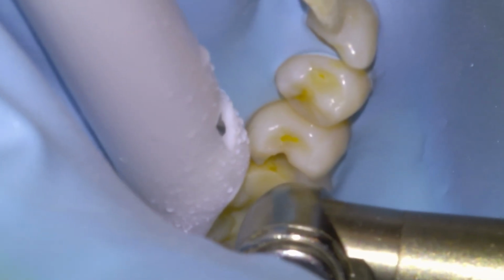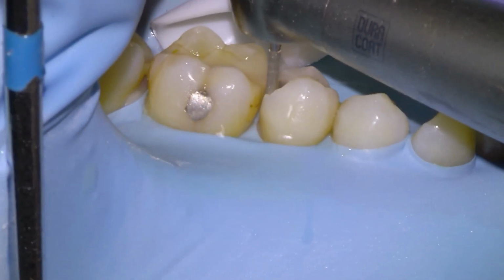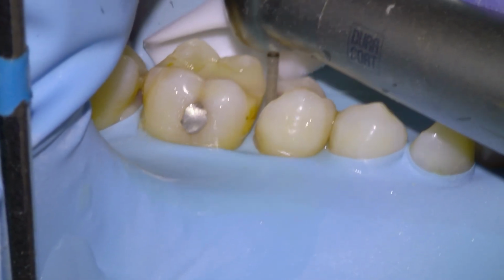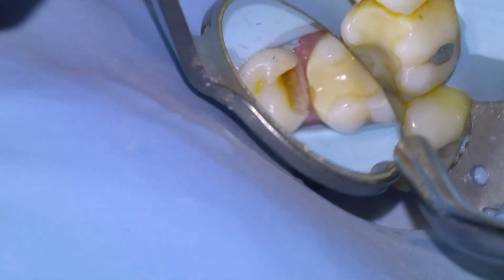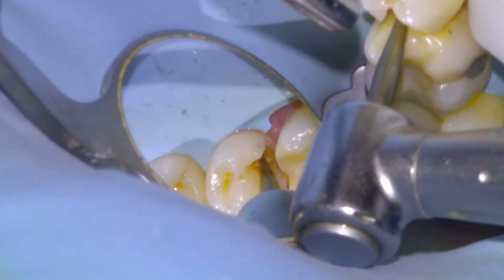So we're just going to open up the buccal and lingual contacts, switch over to the 9 o'clock position, and then finish opening them up from this position here. I'm actually just going to snip the septum. It gets in the way. Sometimes if you inadvertently clip it, it can kind of blow the whole thing apart. So there we are. Still going to be a bunch of soft tooth decay in there.